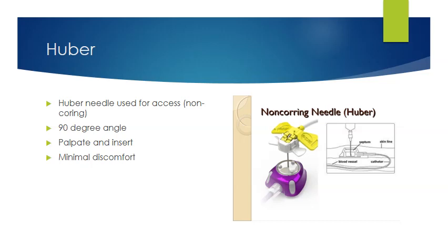Okay, there's minimal discomfort with the patient. They barely even know they're being stuck, if they know at all. I always say I wish God had made us all with an implantable port, because how wonderful would it be to never have to be stuck again? This is not even like a bee sting. I mean, you barely even feel it. It's just like a touch.